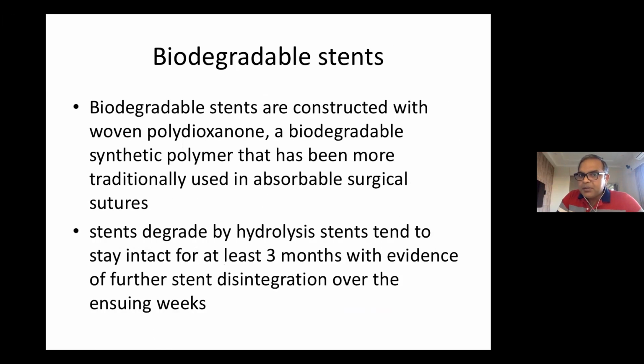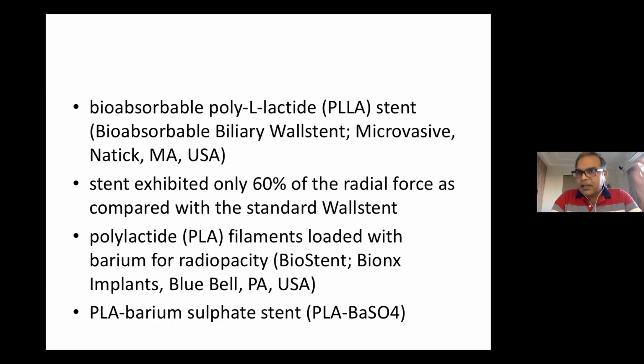So there are biodegradable stents that possibly may come. There is very little literature available on that. The concept is that within 3 months they start disintegrating, just like the coronary scaffold you have heard about, meaning no stent is left. You place it, you can keep an access tube, and it slowly disintegrates, and there is no metallic thing left inside. Basically it is the polylactide acid, PLLA, stent, which is a bioabsorbable biliary stent.